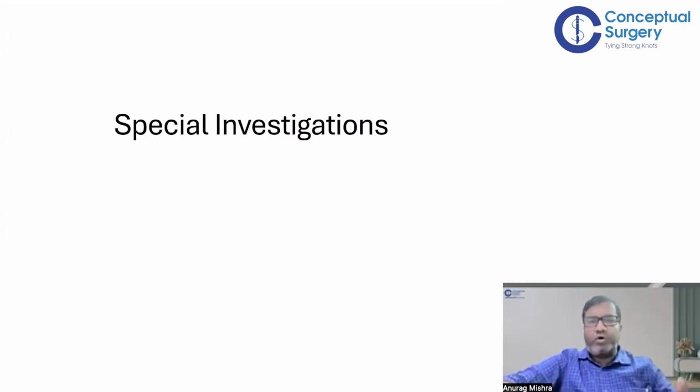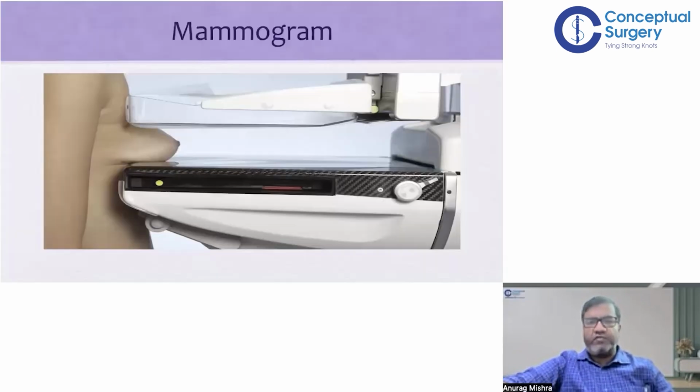Again, we'll be talking more about the basics, and then we'll leave it on you to practice and get more in the habit of seeing the investigations and then interpreting them. So the first investigation we are going to talk about is a mammogram. Now, we know in surgery, because of the high rise of carcinoma breast, we do a lot of mammograms. And so we need to understand what a mammogram is so that we are able to analyze it properly.